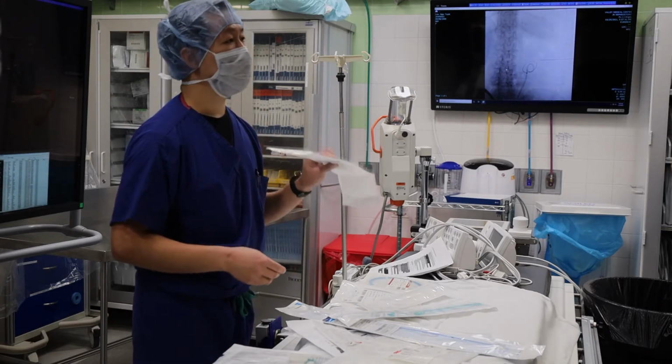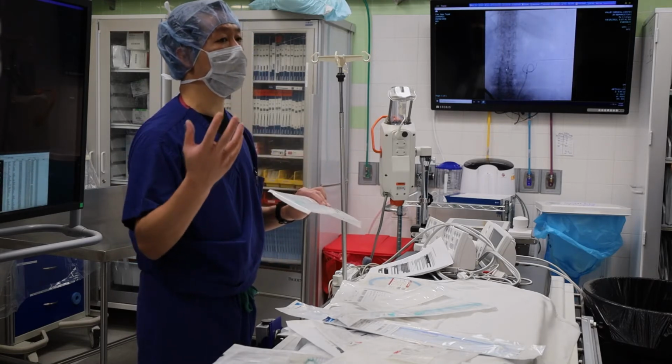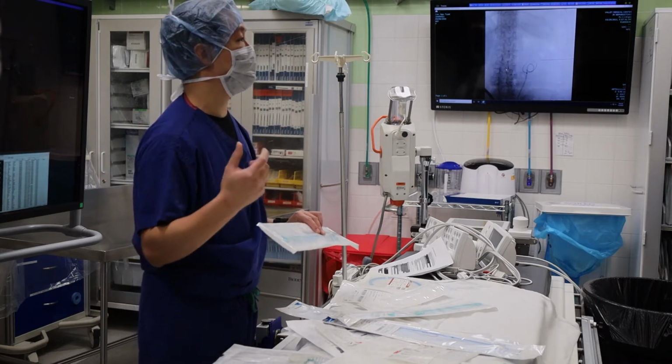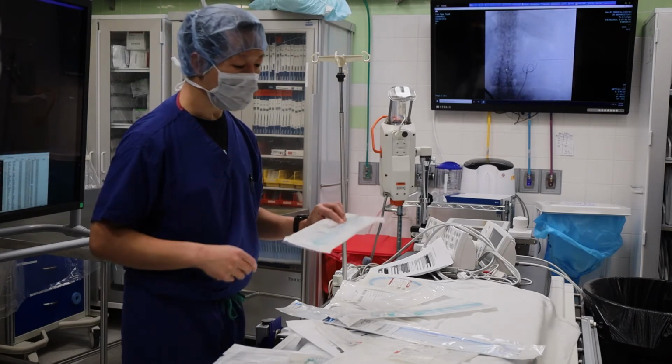Sometimes we don't inject, and the reason for that is that in an infected system, you want to decompress, you don't want to add pressure. If somebody is overzealous, it goes BAM! You've just pushed all that bacteria into the bloodstream. And so that's why sometimes we don't do that.